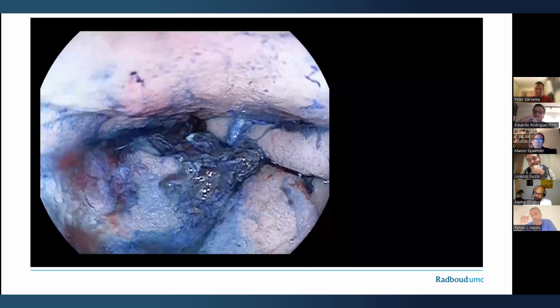The suturing is something that I like to do for essentially iatrogenic strictures post circumferential ESD. If we put a stent in, then I'll suture them in, just because I don't like the tissue ingrowth that you get with the stent fix, because that can create some discrepancy when you're sampling a post-resection site. Yeah, that's a good point. Maybe that's also an argument to consider suturing.